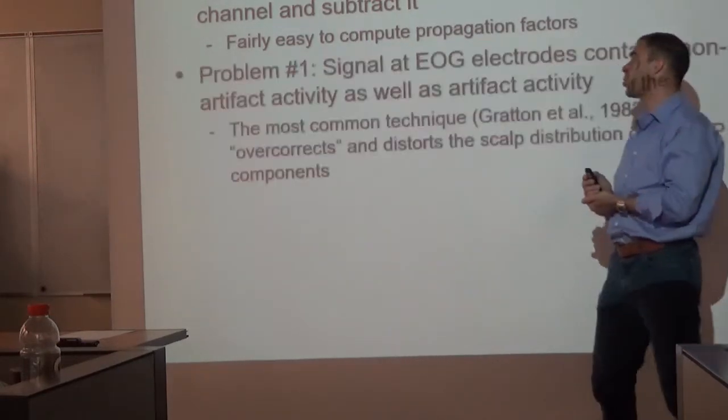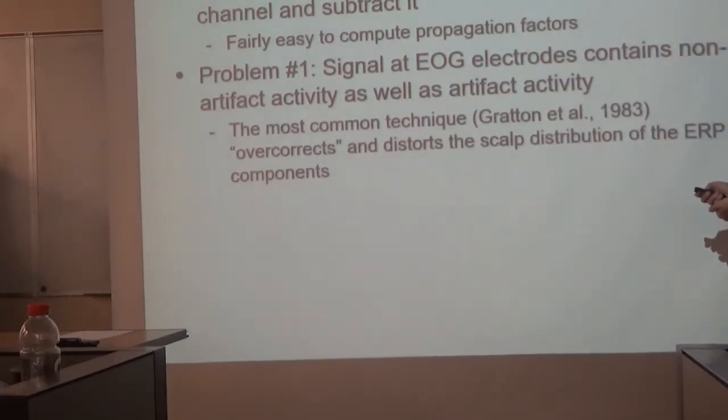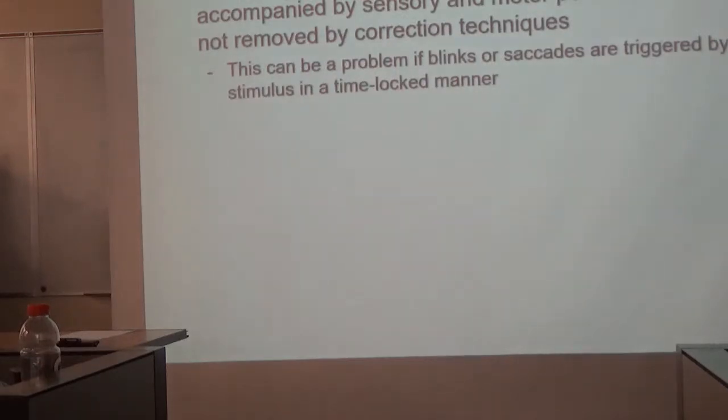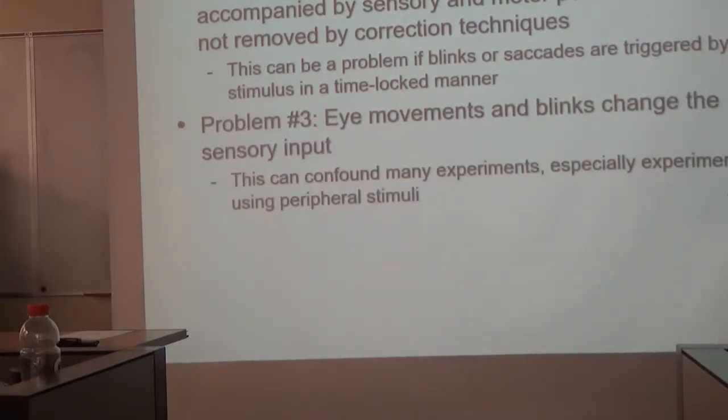What I wanted to do is keep it simple and just introduce the idea that with ICA, you're subtracting that information out.